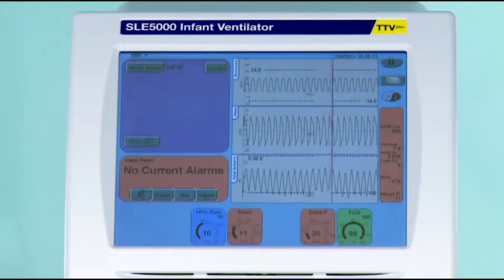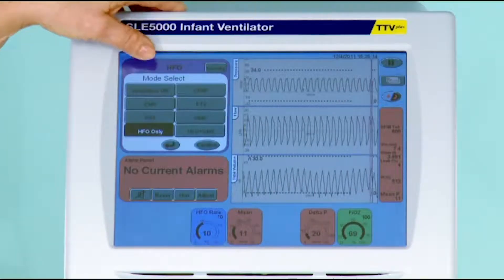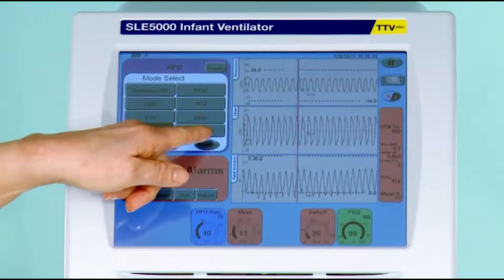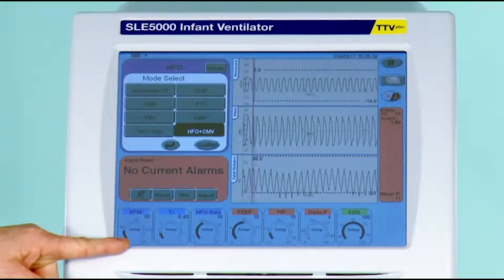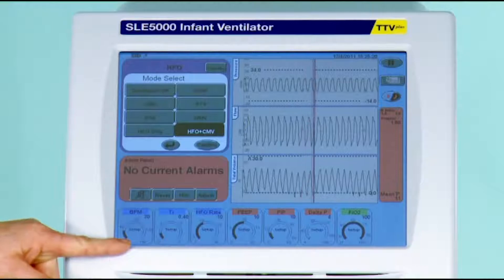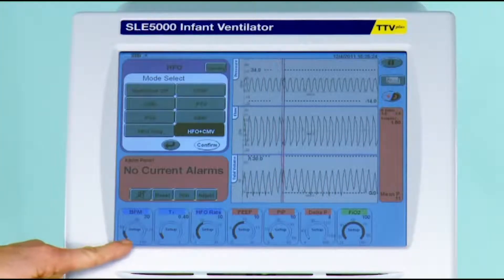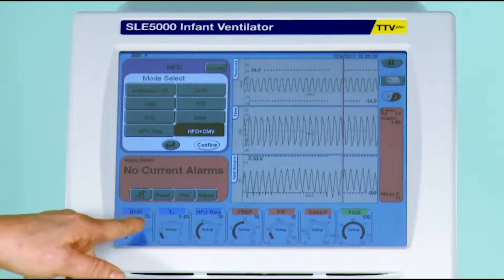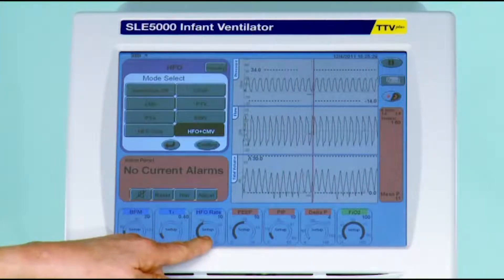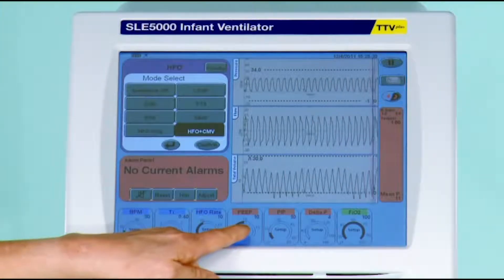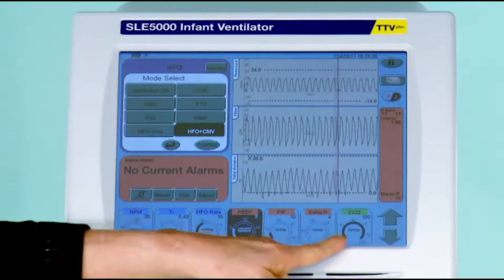There is another mode of high frequency oscillation ventilation that combines both high frequency and conventional mandatory ventilation. If you select it, you will get a rather confusing screen, and you would need to set the ventilator up as you would for CMV — setting the breath rate, the inspired time, the HFO rate.